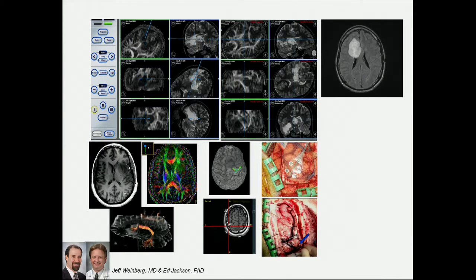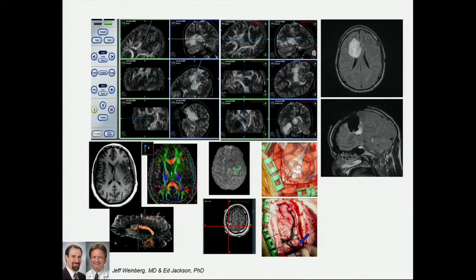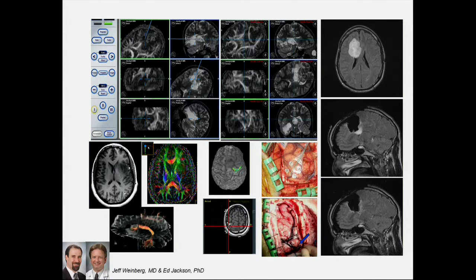And you could easily see, big tumor there. So the surgeon goes in, based on all this data they've integrated, they'll do their surgery, and then they actually put the patient in the scanner and rescan them during the middle of surgery. And you can see here, in this case, they missed some of the lesion. The problem is, as they're debulking this lesion, all the anatomy's changing, okay? So you look at it and go, why don't they scoop the whole thing out? Well, they're taking it out, and everything's changing. And they're wanting to, again, preserve function. So they're trying to cut out as little or as much as they can without affecting function. Then they went back and did a little more surgery based on this, and they were able to get a pretty clean margin on that. There's just a little bit of edema, which is probably not disease.